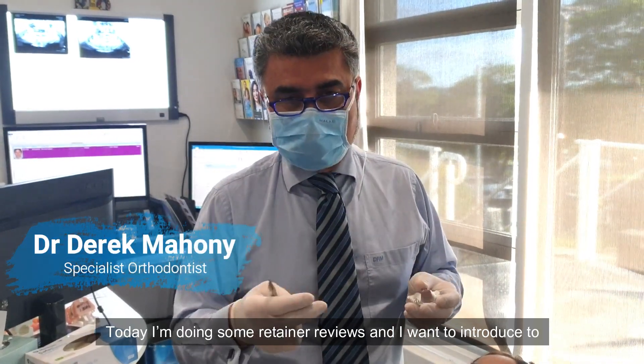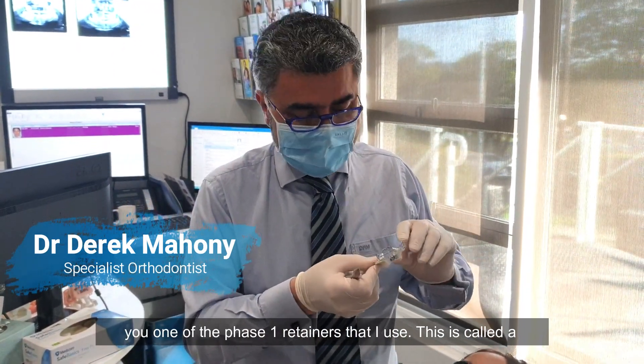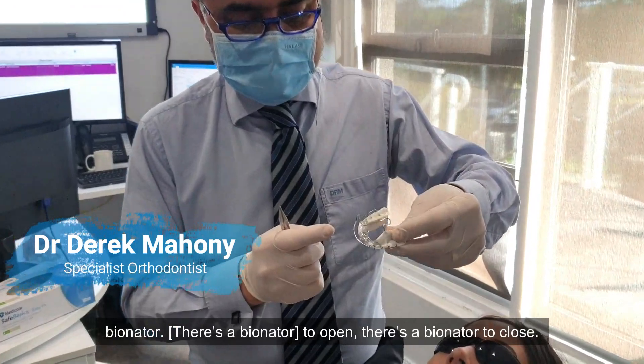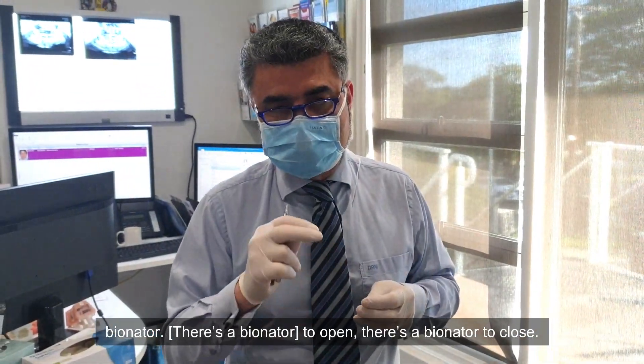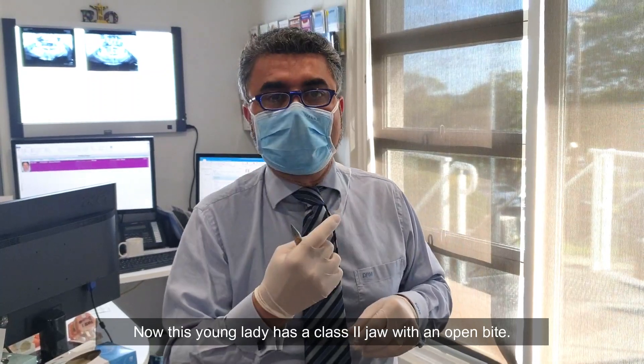Today I'm doing some retainer reviews and I want to introduce one of the phase one retainers that I use. This is called a bionator — here it is open, and here it is closed. This young lady has a class two jaw with an open bite.